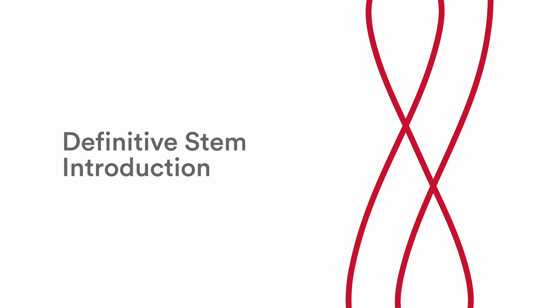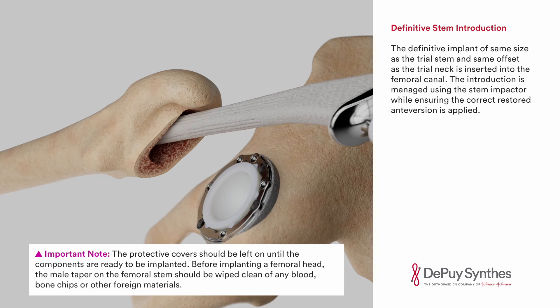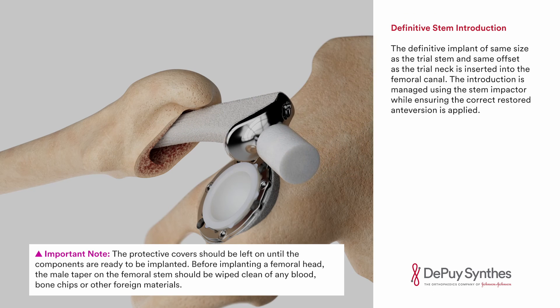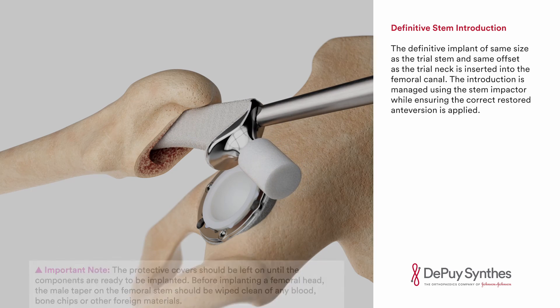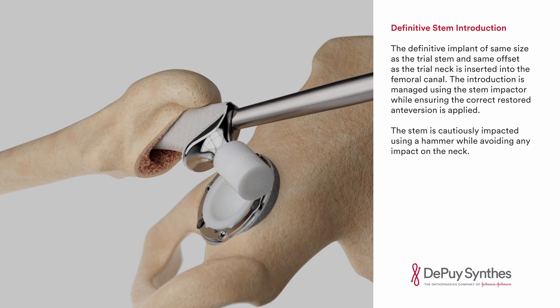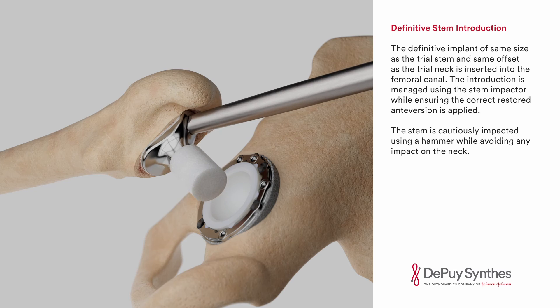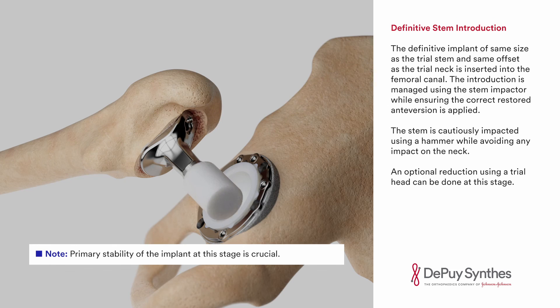Definitive stem introduction. The definitive implant of the same size as the trial stem and same offset as the trial neck is inserted into the femoral canal. The introduction is managed using the stem impactor while ensuring the correct restored anteversion is applied. The stem is cautiously impacted using a hammer while avoiding any impact on the neck. An optional reduction using a trial head can be done at this stage.